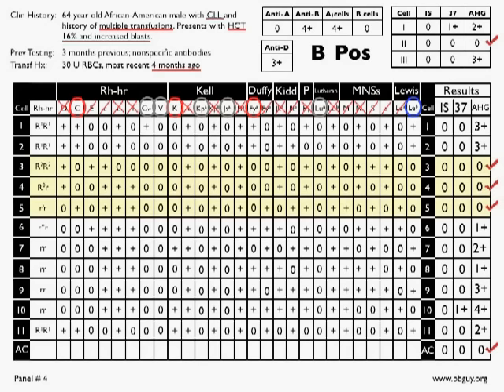So we're going to focus our attention on the other 3, which is anti-Big C, anti-Big K, and anti-Duffy A, and you see those 3 right here. Okay, so with those 3, we need to take a look at things and see what we can do with this panel. Well, this is a difficult panel, obviously. We've got a lot of positive cells and a lot of variation, but let's just start by, again, as always, seeing if there's one antibody that can do all this. I don't expect there to be, and neither do you, but let's see.